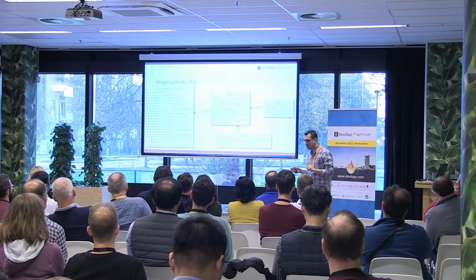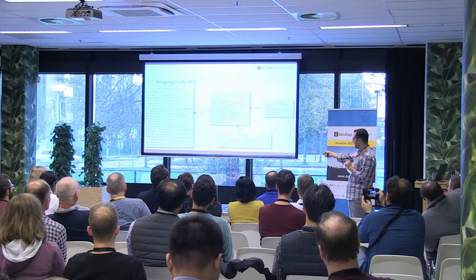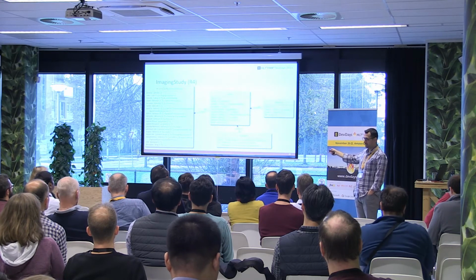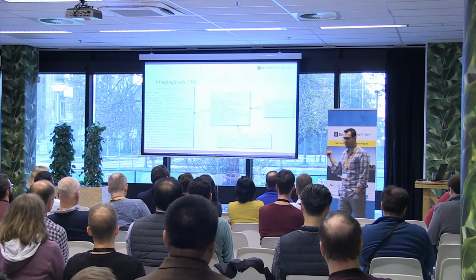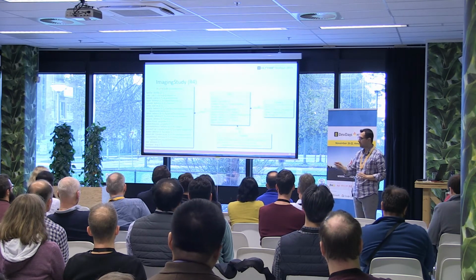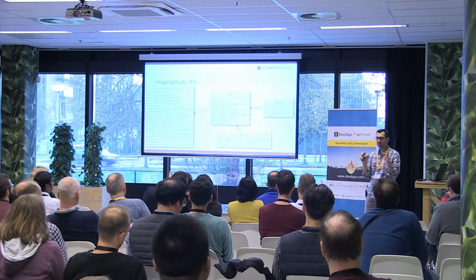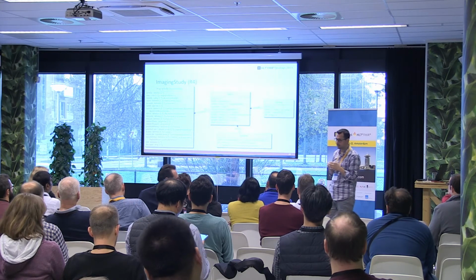That being said, I don't know if every example you're going to find in real life will have all three of these populated. And let's leave performance aside for a moment. In my experience, I've seen the majority go down just to the imaging study level and skip series and instance. Now, hopefully, I've seen the worst and you see better than what I've seen. But if you do see what I see, generally speaking, the assumption here is they give you the imaging study, which is the information you need to know about the study. And then if you need more information about series or instance, they are just simply expecting you to go to the PACS system, talk to it, and get that information that you need. So PACS, for those of you who are uninitiated, is a system that speaks DICOM. Does this make sense?